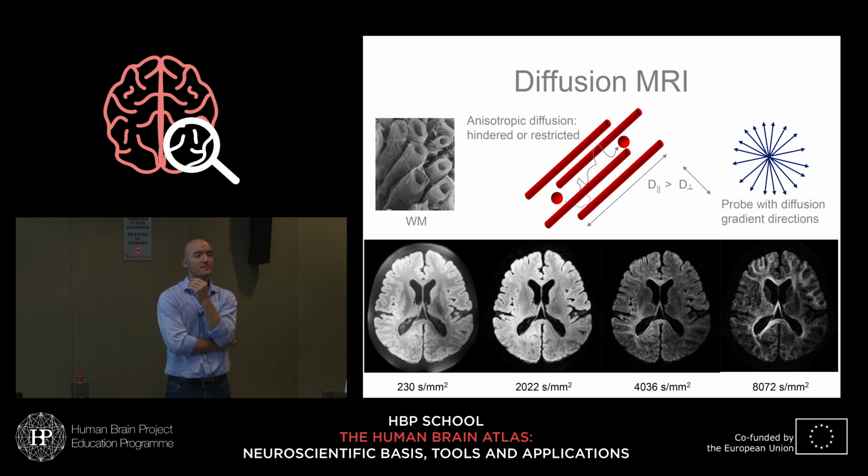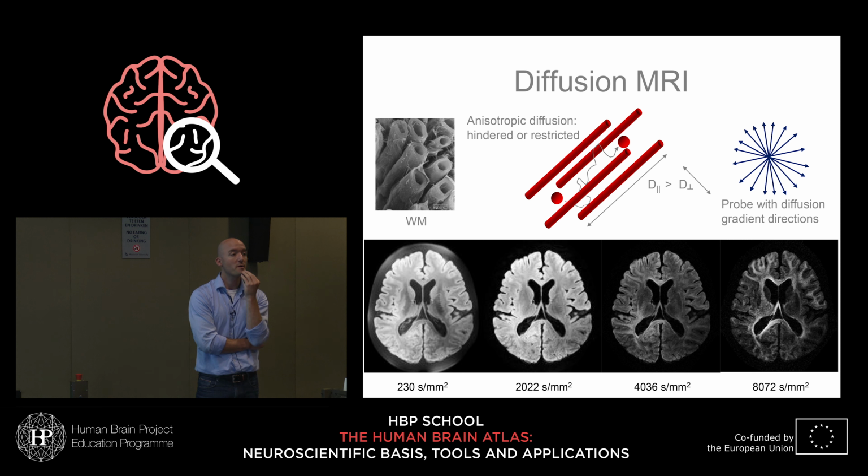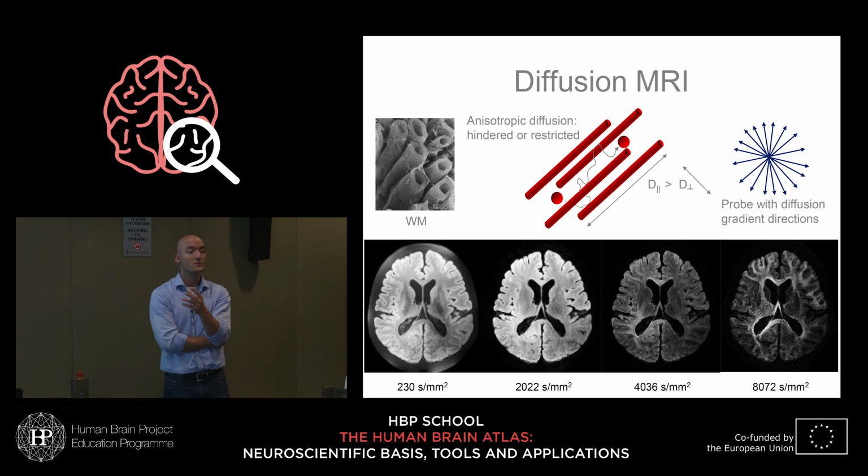Anatomical T2* weighted imaging on postmortem brains, if you work for 2 or 3 years on the coils and the sequences and the 9.4 scanners, can be very thankful because you can get 75 micron isotropic. Diffusion is much harder. Diffusion to start with is much more SNR starved than anatomical imaging. So anytime you see 1 millimeter isotropic in vivo with MP-RAGE, or SPGR as GE would call it, you will see at least 8 times that voxel volume on diffusion. So diffusion will probably be 2 millimeters. That's because diffusion has much less SNR than many other measurements.